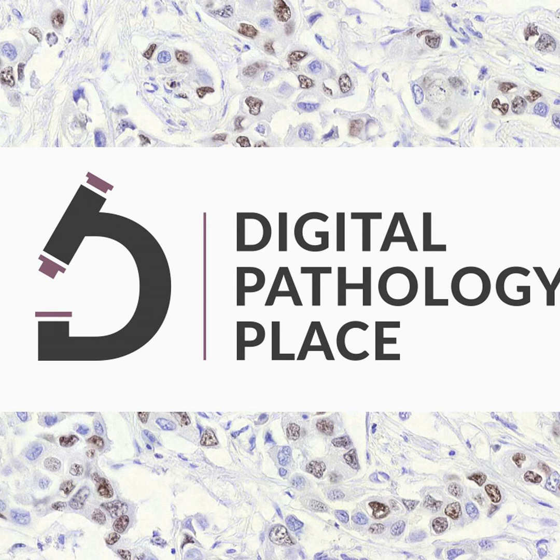One of the mainstays of digital pathology lies in its capacity for primary diagnosis, notably in the realms of surgical pathology and cytopathology. In surgical pathology, digitized slide images serve as the foundation for comprehensive histopathological assessment. These images, taken from tissue samples excised or biopsied during surgeries, are meticulously scrutinized by pathologists for abnormalities.